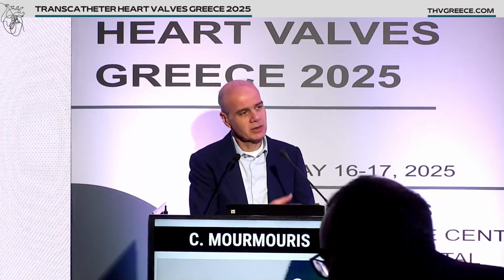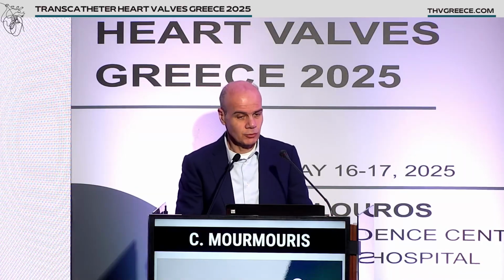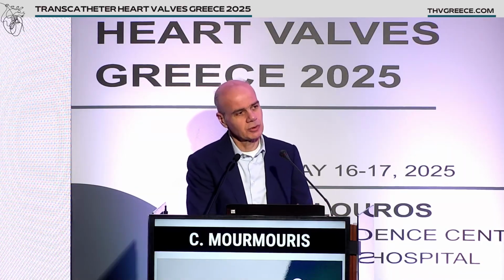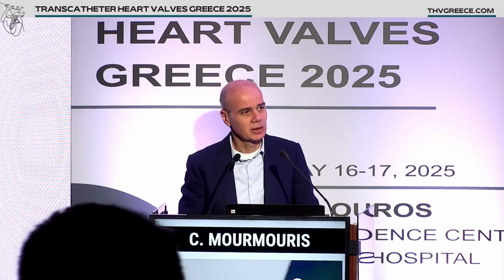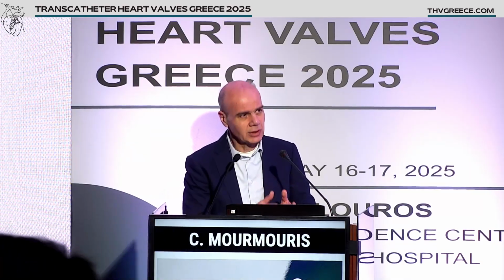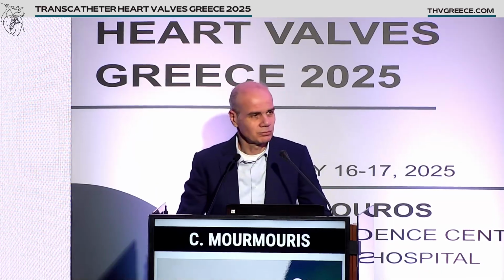Then the second phase is a mixture of 40% contrast and 60% saline, and then just saline. In TAVI, we only perform one phase. We should wait a little bit because of the venous return, and also for some specific valves, we should also see the superior vena cava from the neck.